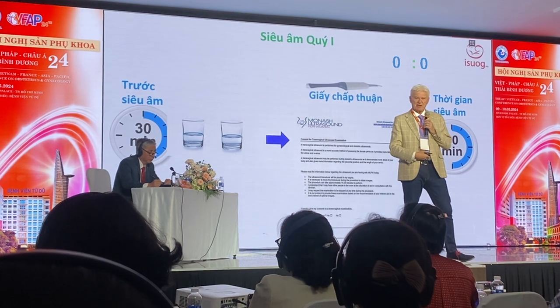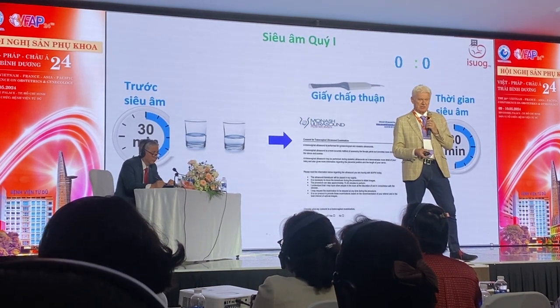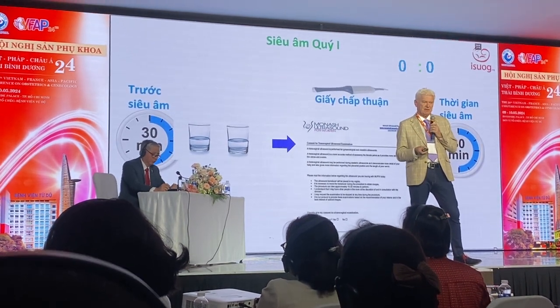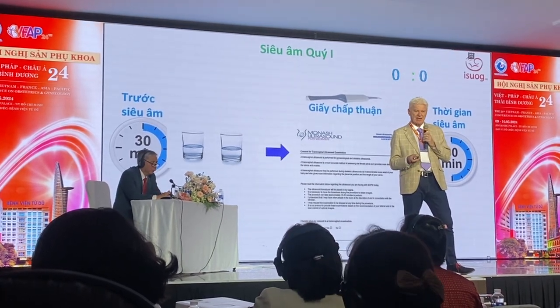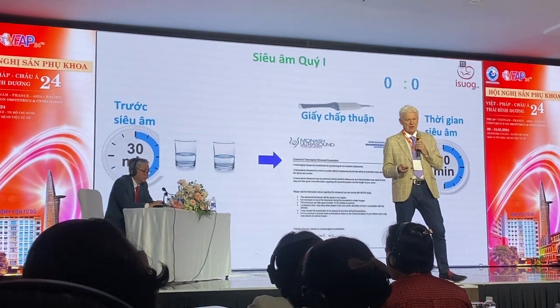It's easier to measure the crown-rump length. It is easier to take a nuchal translucency measurement transabdominally. And we do BPD, HC, AC, and FL. And we calculate the biometry and the gestational age. We assess whether single or multiple, and then we screen.